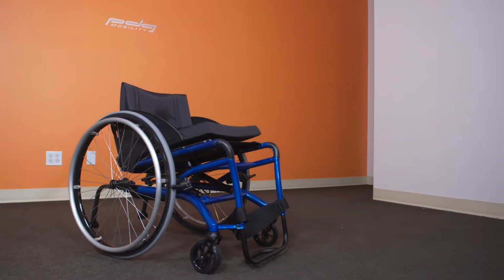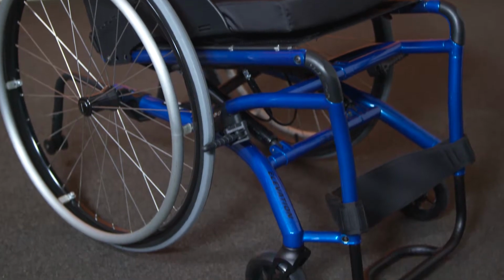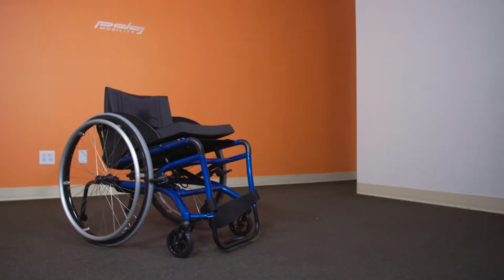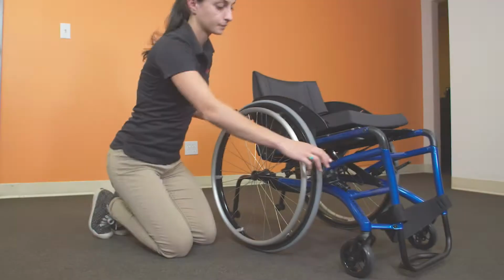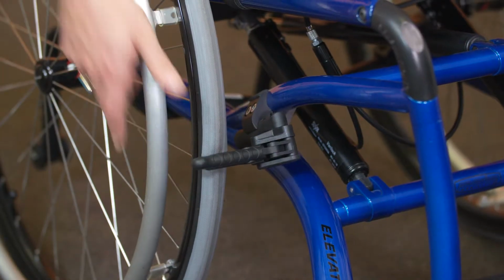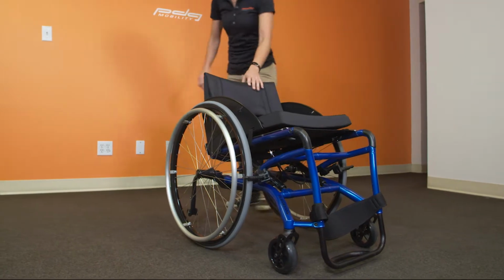The first step to removing the struts from the wheelchair is to ensure that they are fully decompressed or extended so that if they get accidentally activated while working on the chair, they do not cause any sudden movement of parts. To do this, engage the wheel locks and lock the rear wheels to ensure the wheelchair stays in position as the struts are activated.